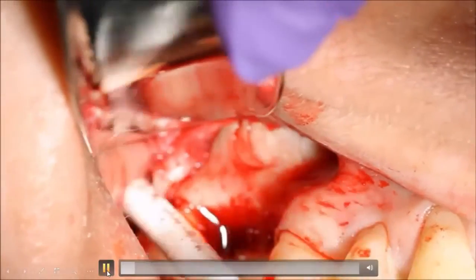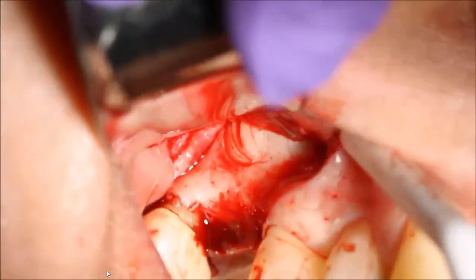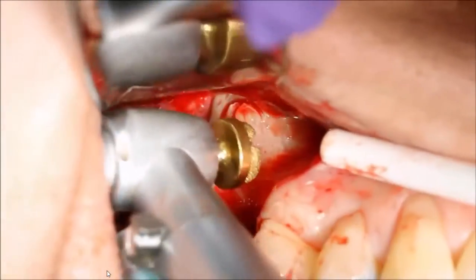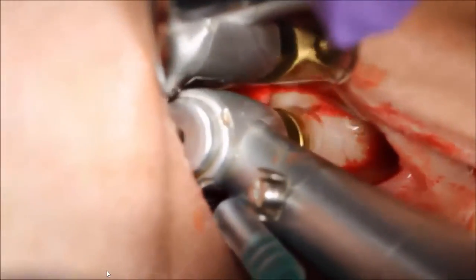Now you will see I will use what we call the disc bur. It's a large diamond bur and it's actually a safe bur. It doesn't perforate the membrane. We use it at 45 degrees. We make strokes mesially and distally until we reach the Schneiderian membrane.